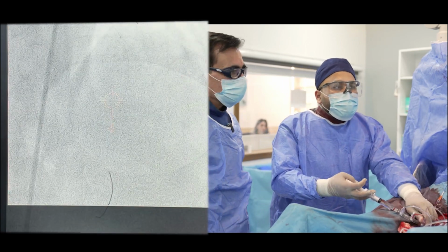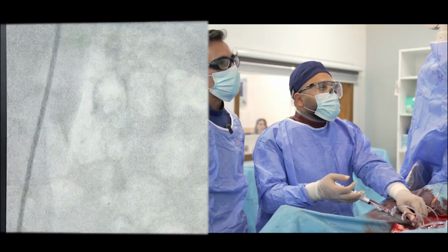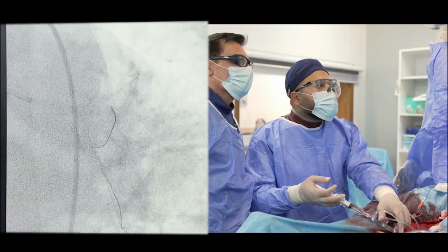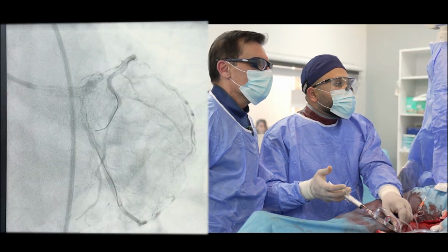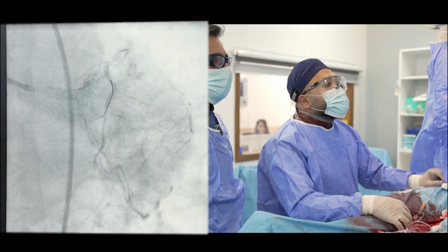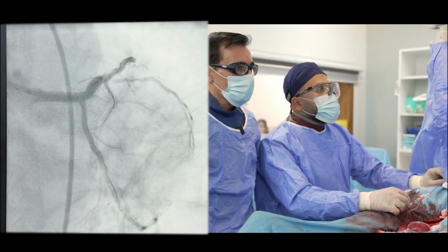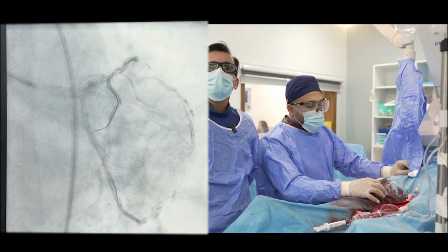Frontal caudal. Otherwise, it's not a difficult job to stent it. Okay, angio. Yes, and the circ is very good. And by this, we conclude the case. And thank you.